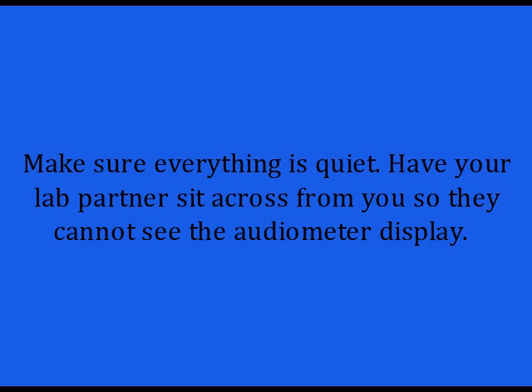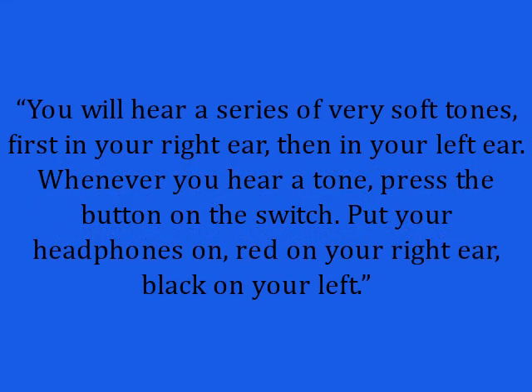Read this to your lab partner: "You will hear a series of very soft tones, first in your right ear, then in your left ear. Whenever you hear a tone, press the button on the switch." Put your headphones on — red on your right ear, black on your left.